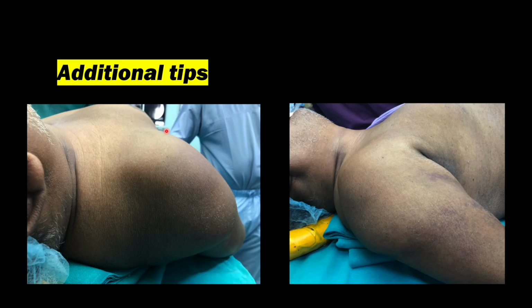Additional points should be taken care of whenever you are operating on the patient. If you are taking the patient slightly inwards, always keep a thick sandbag underneath the scapula. Why? Because that is going to lift the shoulder above the level of the table, and you will be getting a good axial view because it is not going to get hindered by the surface of the table. As we discussed, the metallic edges are going to obscure our view. If the shoulder is free of this metallic edge, you are not going to face difficulty in getting the lateral view. Also, whenever this part is pushed by the table, you face difficulty in reducing the fragments. So always keep a sandbag underneath the scapula. That is going to make the whole of this shoulder part free of any pressure from the posterior direction.